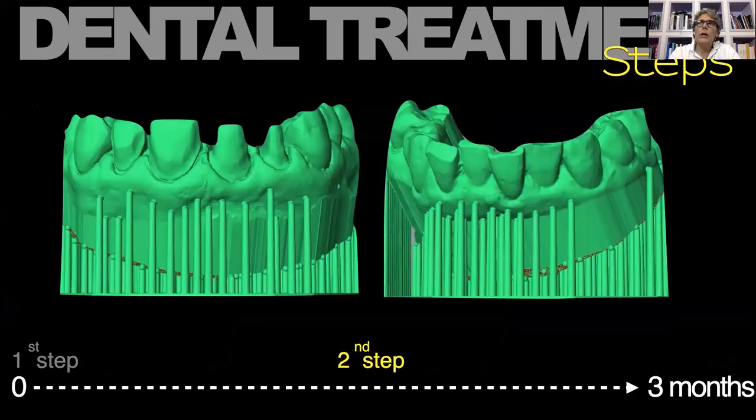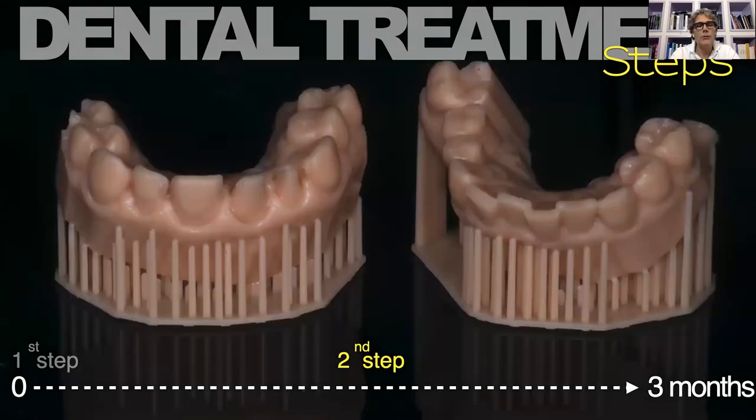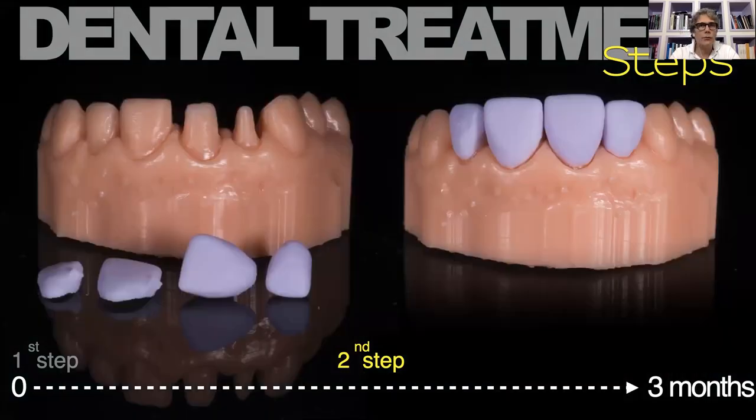In my modern approach, when I have to manage more than one tooth in the frontal areas, I always print with my 3D printer a master model in resin that I am able to create starting from the STL file of the impression, previously made by the prime scan. Sharing the STL file with my 3D printer, I print the master model with the tips prepared. The meaning of this master model is not to check the accuracy and precision of the restoration inside the restoration itself, but this resin master model helps me to check the interproximal contact between the prepared, milled teeth, and as a support during the layering of the ceramic.